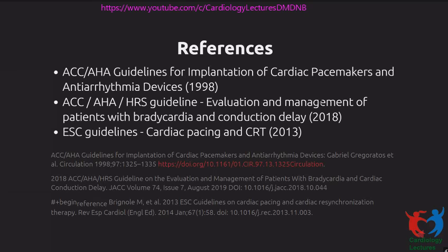But left bundle pacing seems to have better thresholds, better R wave sensing, and is probably a little easier to implant compared to His bundle pacing, which tends to have problems with a slightly higher threshold, and about 10% of patients develop an increased threshold over time. So right now, the pros and cons of each balance each other. At this point, I would say both of them sort of balance out.